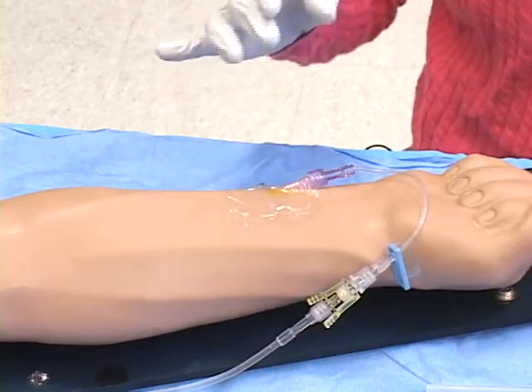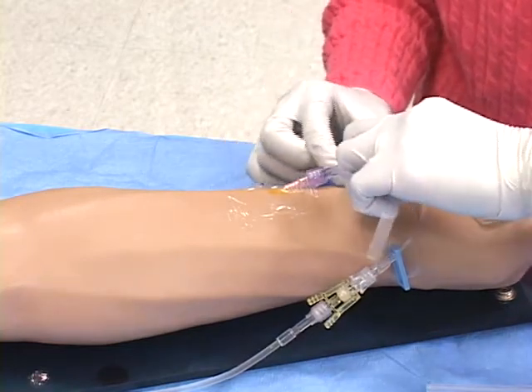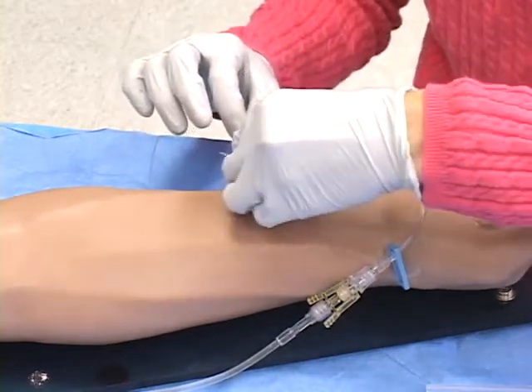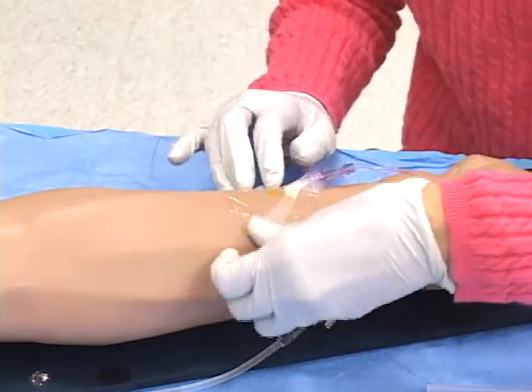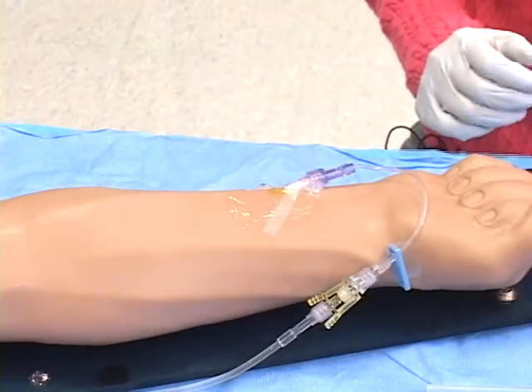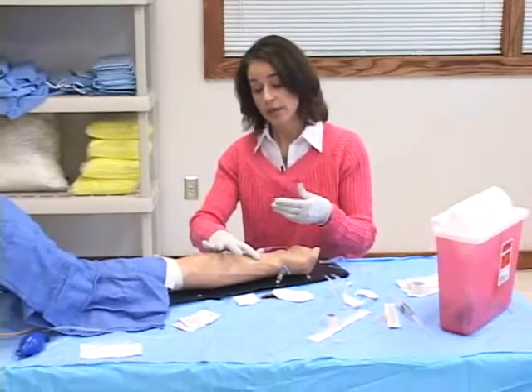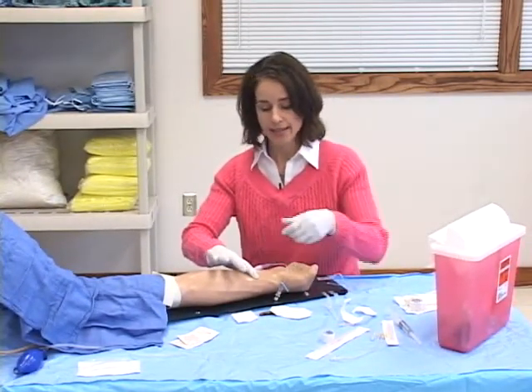Remove the lining of the Tegaderm, and then this is where all these extra pieces of tape come into play. You're going to take your tape and slide it behind the catheter here. And the tape will actually stick a little bit better to the Tegaderm than it would stick to the patient's skin. And you want to be sure when you do place an IV site that you still have nice visualization of the IV access into the vein, because you want to be sure to monitor for any kind of swelling or redness or signs of infection or anything like that.